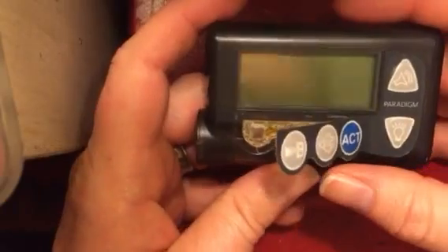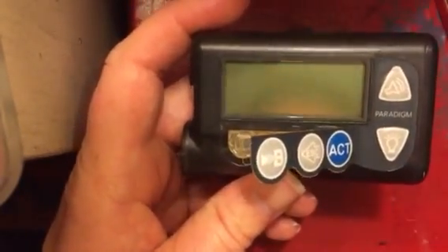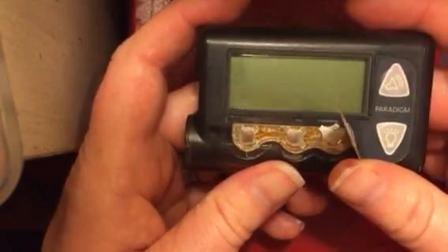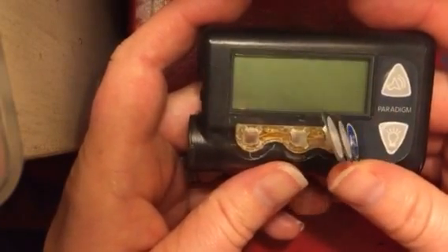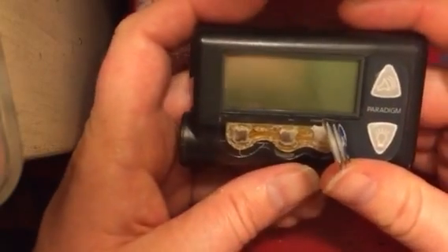The 522 pump has to have the older firmware 2.4. When this pump gave me a button error, I called Medtronic and they said that that's basically like a fatal error — you just ship it back and they replace it. There's no troubleshooting steps or anything like that.